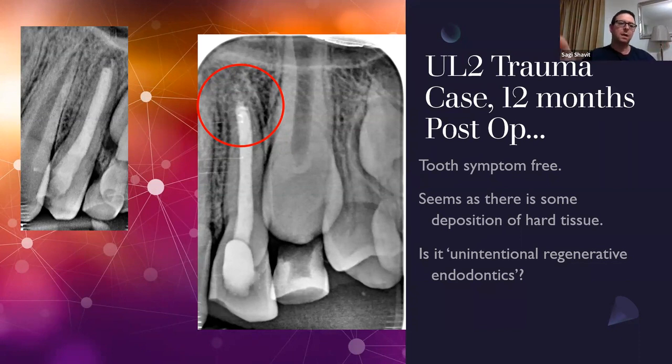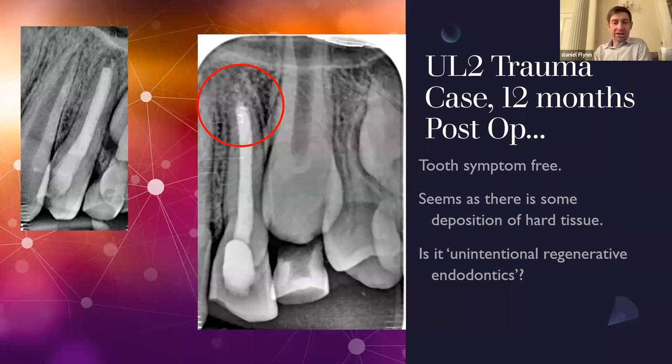Those type of materials, bioceramics, are not only biocompatible, but they're bioinductive. They produce a reaction, a positive reaction from the body. The bone, the dentin, the cementum, the whole shebang, if they're used properly. Yeah, we need to create conditions for it to heal around it.